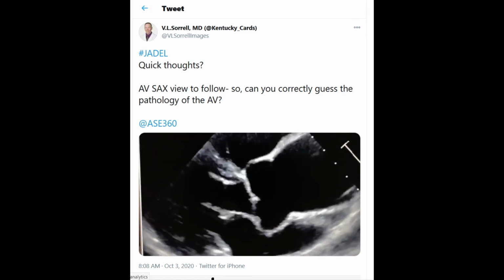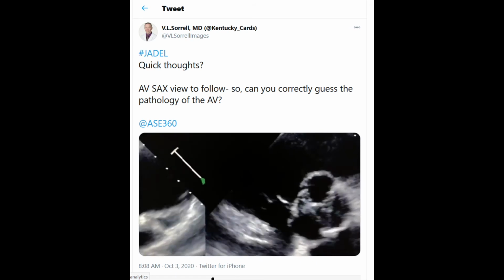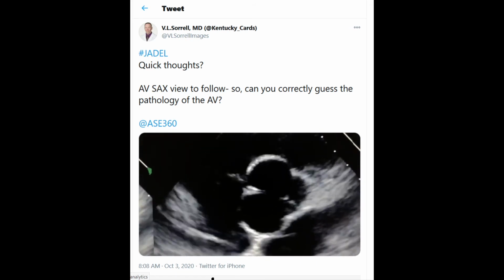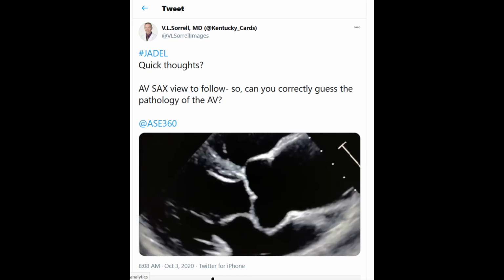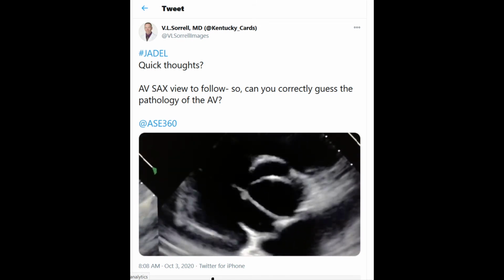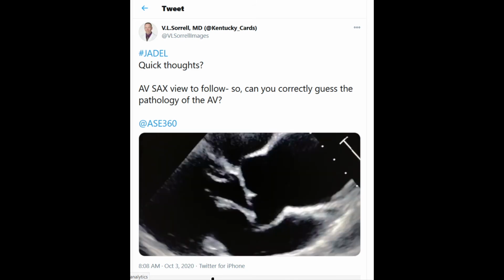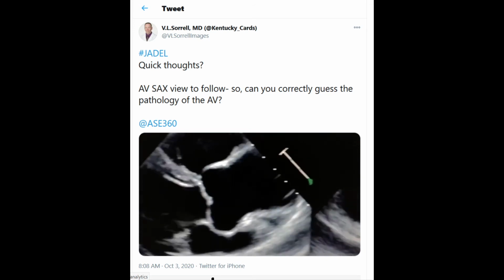Other people were questioning whether this represents dilatation or an aneurysm, and the definition of those should be consistent in your lab. Typically in radiology, we look for a 50% dilation greater than the normal range, and that would represent an aneurysm.